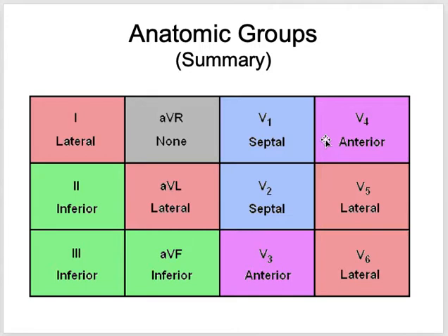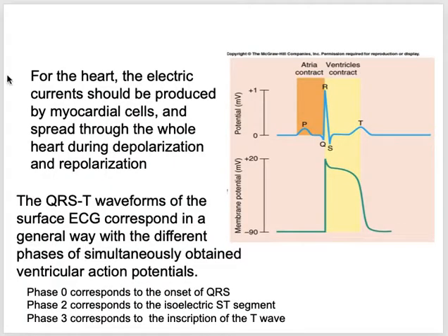Of course, the leads represent the electrical activity at various times in the cardiac cycle. It is not easy to look at every detail each time, okay? So now I will tell you how the ECG looks and the importance of studying these things. See, this is the P wave, then there is the QRS complex, then the T wave in the normal ECG, and then the cycle repeats.